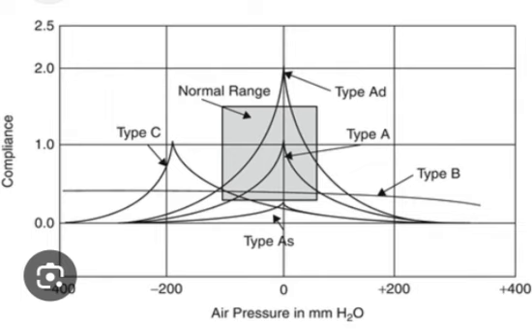There is a distinction between the 3 types as well as the 2 subtypes of type A, namely As and Ad. For example, As will show a stiff middle ear system, or Ad consistent with ossicular discontinuity or a monomeric membrane. Only measures of static acoustic admittance, ear canal volume, and tympanometric width, gradient compared to sex, age, and race-specific normative data can be used to somewhat accurately diagnose middle ear pathology along with the use of other audiometric data.